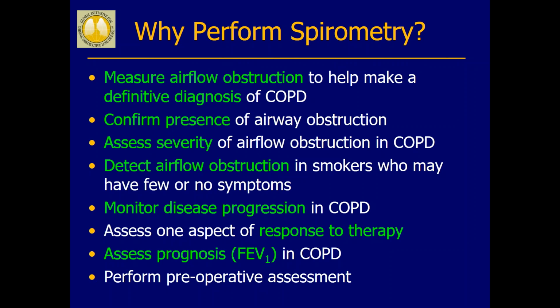And because the slide deck is concentrated on COPD, we also want to make sure everybody understands you can use it for asthma as well. To detect the airflow obstruction in smokers who may have few or no symptoms. Monitor disease progression in COPD. Assess one aspect of the response to therapy. Assess the change or prognosis with the change of the FEV1, and we'll go into detail what that means in COPD. And in some cases, perform preoperative assessment.